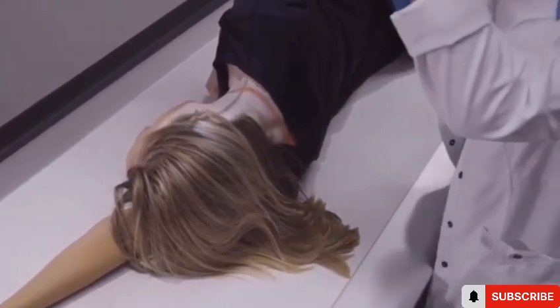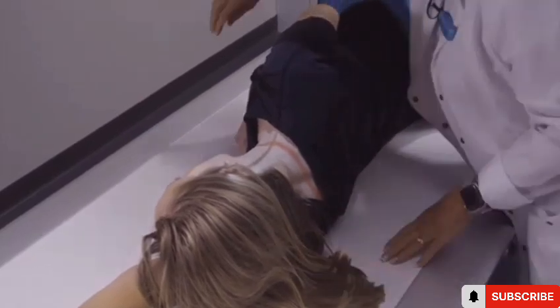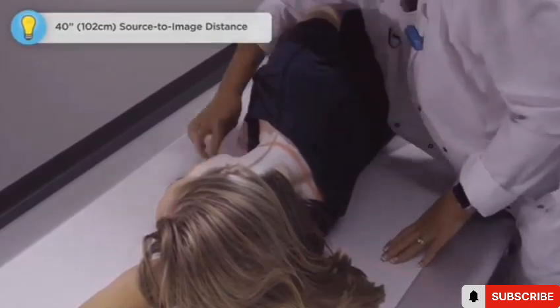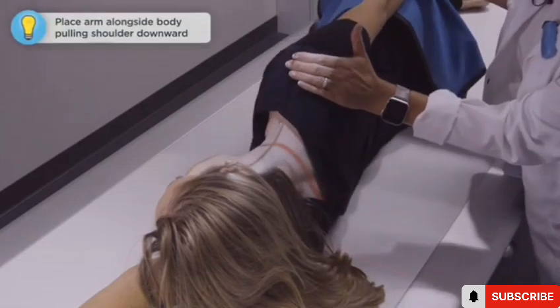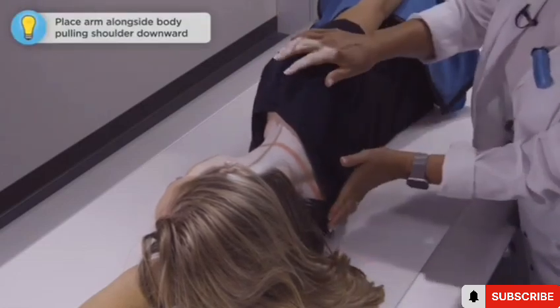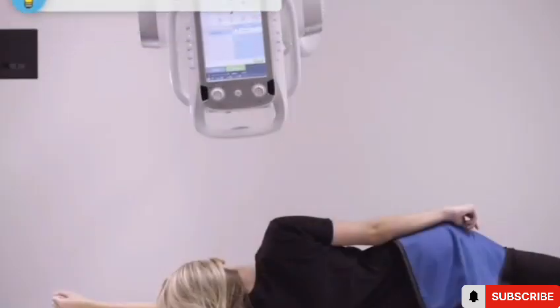I'm going to collimate down to about a 10 by 12, keeping the left marker anteriorly. And we're going to have her take her arm and place it down by her body and pull the shoulder down. We're going to do suspend respiration. Patient's going to hold very still, and the exposure is made.